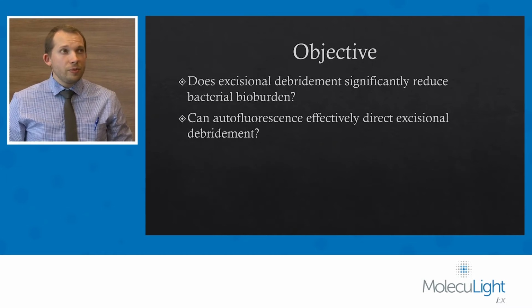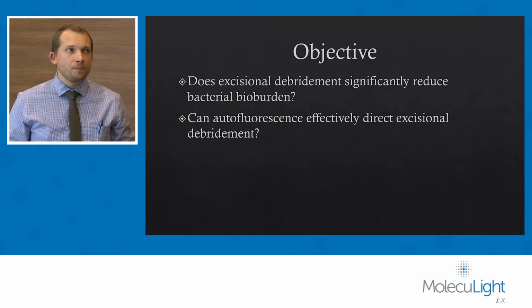So we designed a study around this with 2 questions. 1, does excisional debridement significantly reduce bacterial bioburden? And 2, can autofluorescence effectively direct excisional debridement?